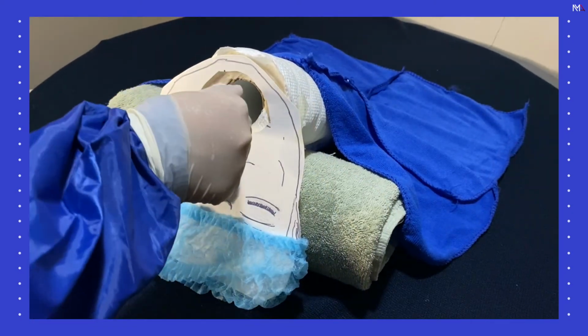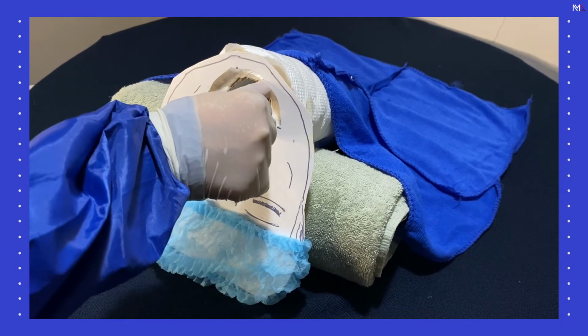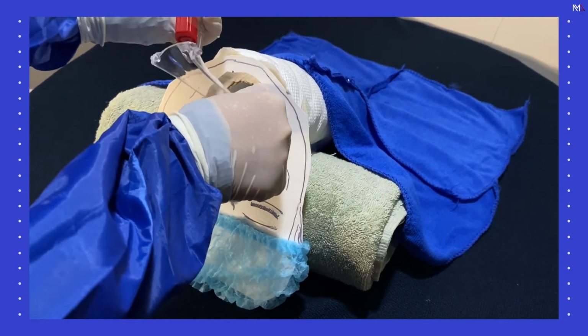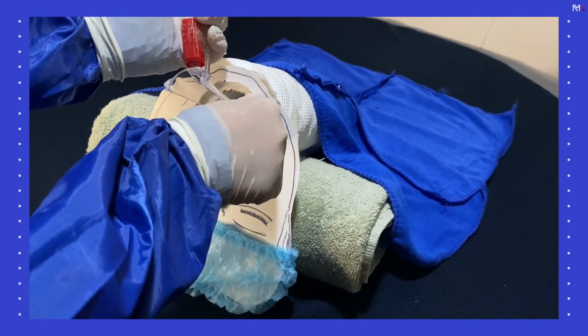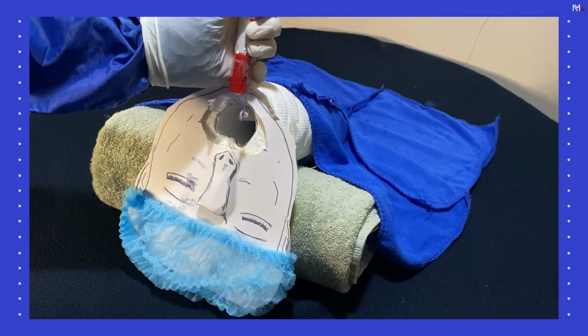Open the mouth fully using the scissors technique. Hold the laryngoscope with the left hand and enter at the right corner of the mouth, then sweep the tongue to the left. Move towards the vallecula to visualize the glottis opening.